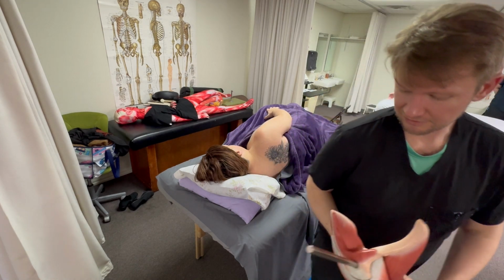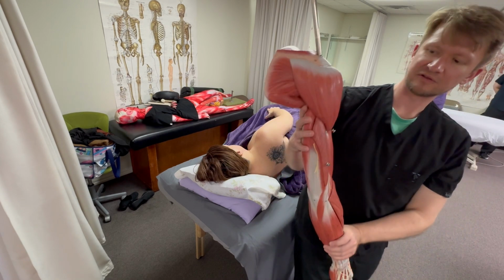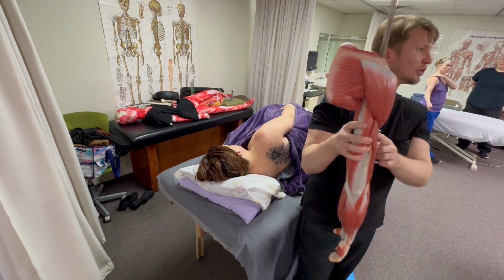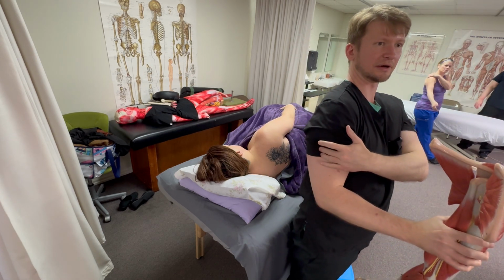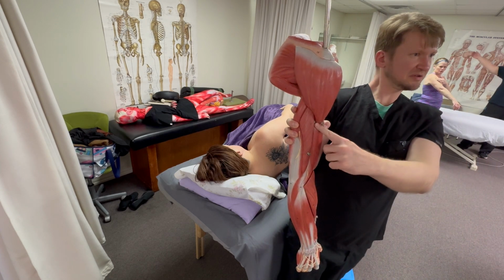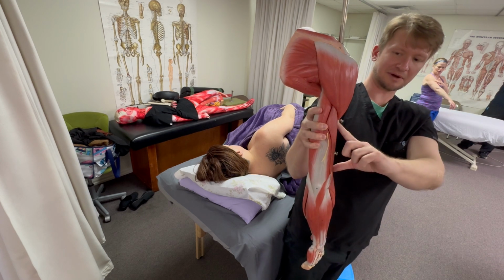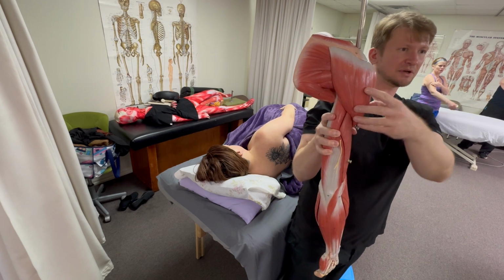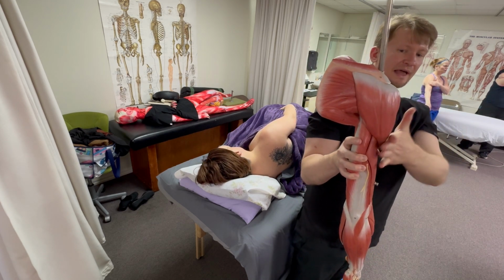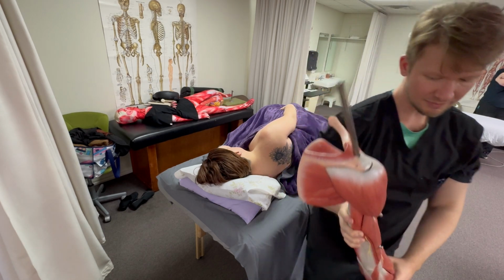So that's all that would look like, and I'm not going to do too much, but real quick, looking at this, remembering that it comes down so low onto the lateral portion of the arm. It's not up here. You've got to try to tape pretty low, almost halfway down the arm, it seems, right? So it's a bigger muscle than you realize, even if it doesn't feel like it has a lot of bulk. It covers a lot of distance. So we've got to try to get all the way down there with some of our tape.